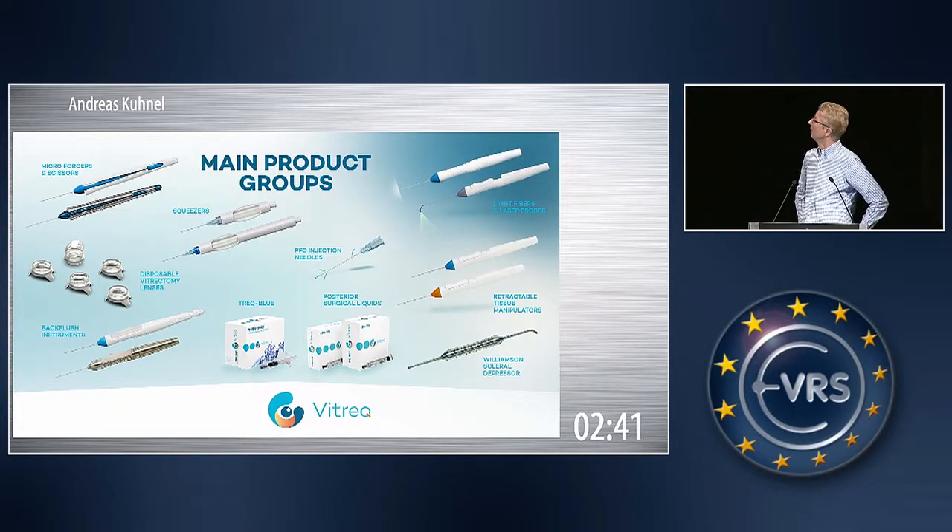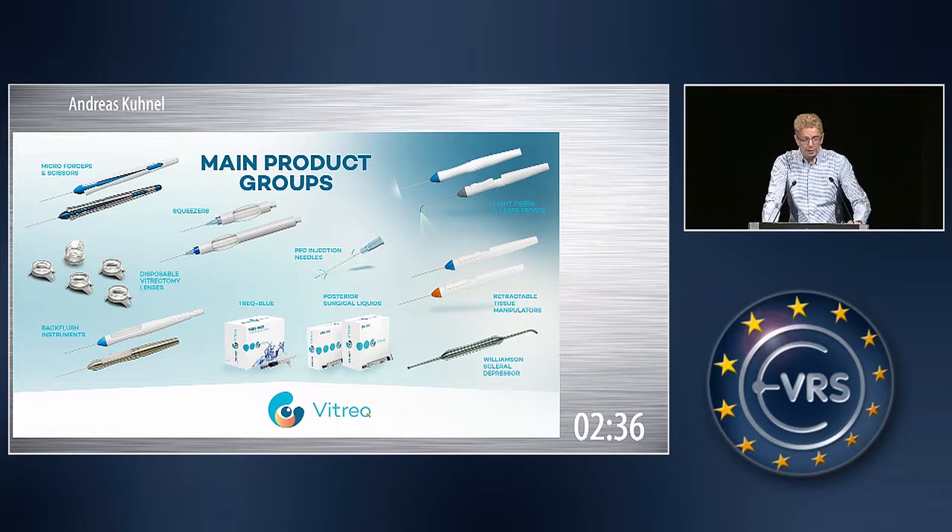Here you can see already how much our product portfolio has grown within one year. And I would just like to highlight now some of the innovations we are showing here for the first time.